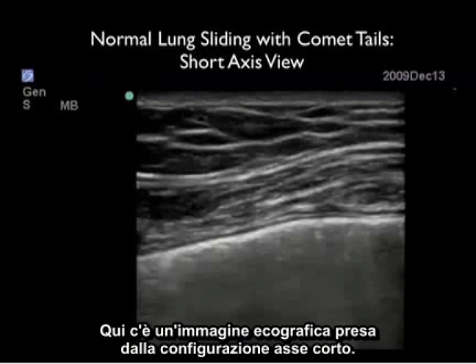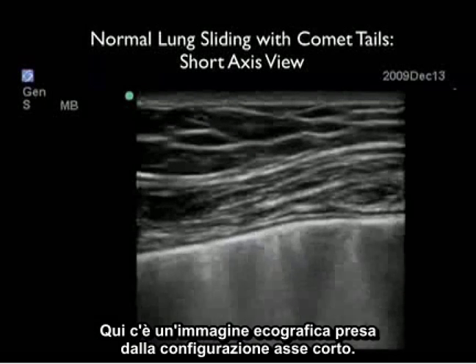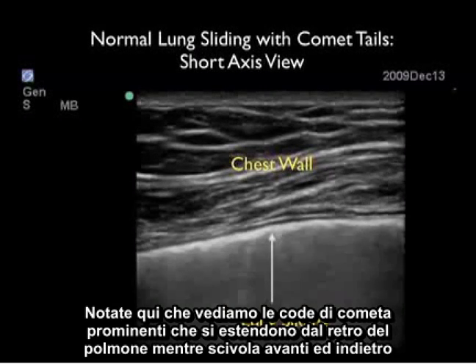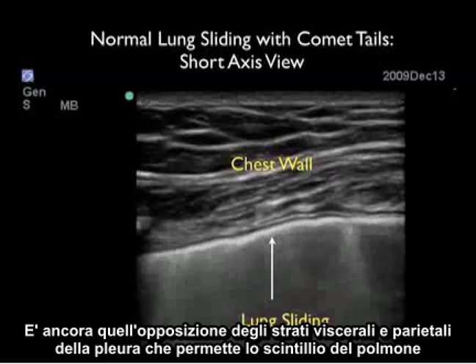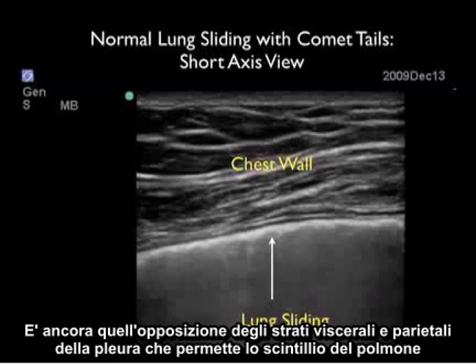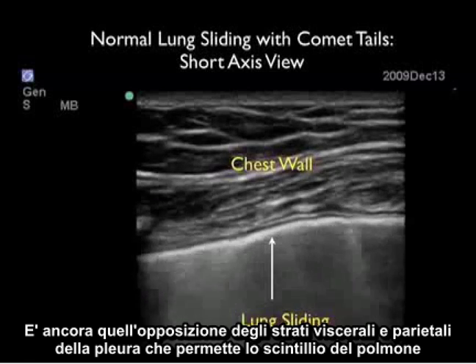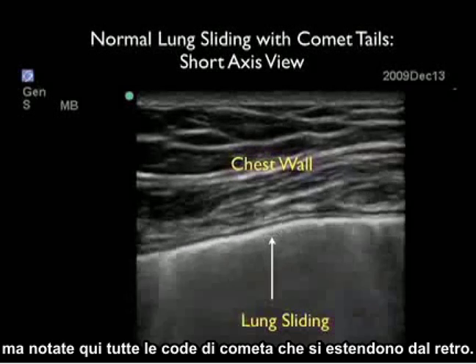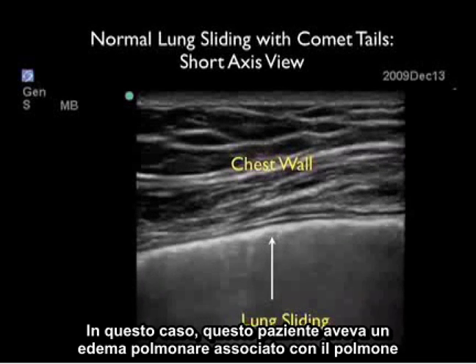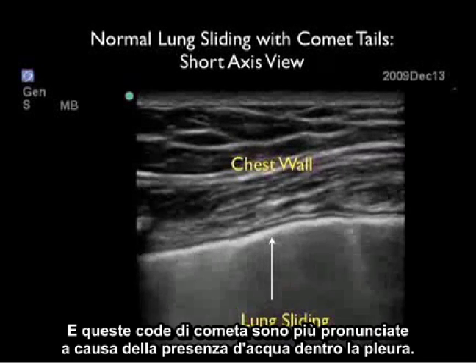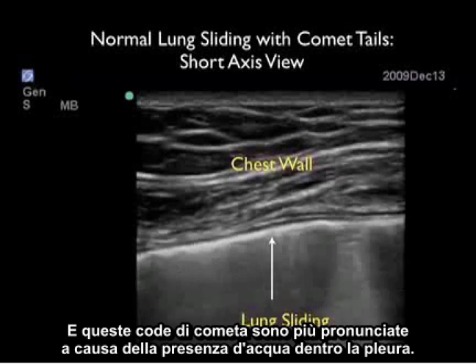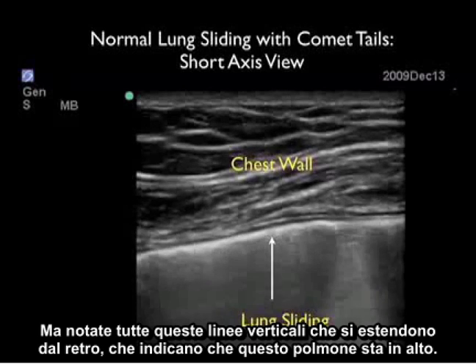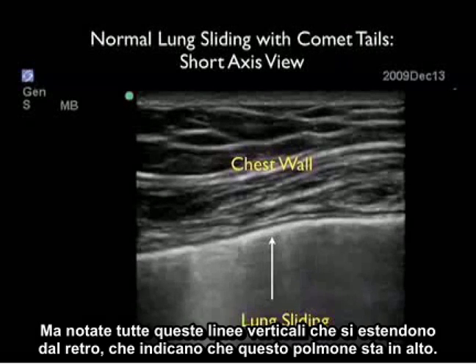Here's another ultrasound image taken from the short axis configuration. We see very prominent comet tails coming off the back of the lung as it slides back and forth. It's the opposition of the parietal and visceral layers of the pleura that allows the lung's shimmering. In this case, this patient had some pulmonary edema associated with the lung, and these comet tails are more pronounced due to the presence of water within the pleura. But notice all these vertical lines coming off the back, telling us this lung is up.